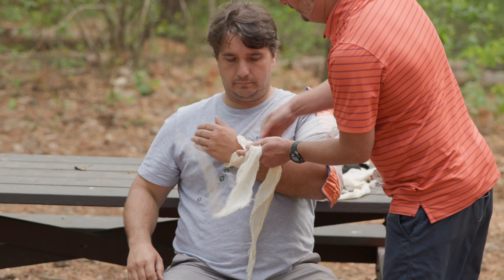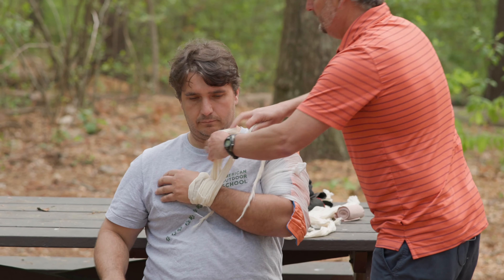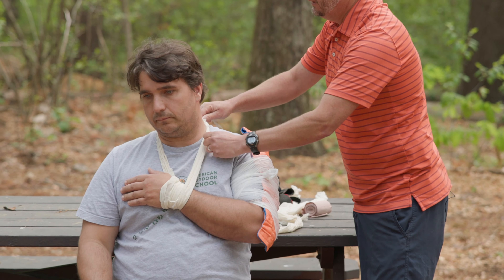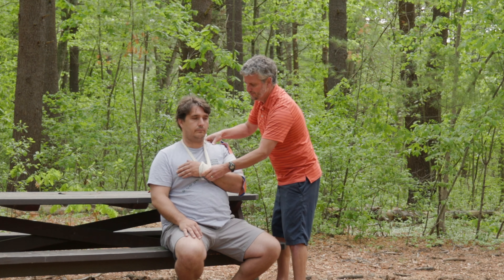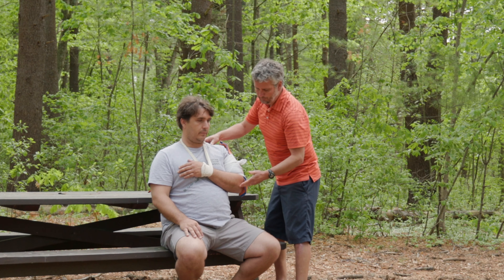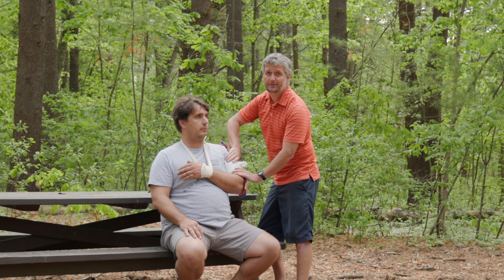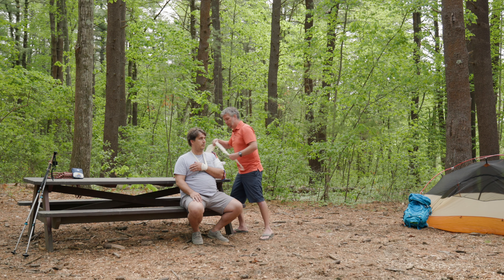I'm going to take my cravat, my triangular bandage, and I'm actually going to wrap it around the patient's wrist — just like that, a simple wrap. Now I'm going to come up and around their neck, with padding in behind, and tie the knot off to the side. What this does is it allows me to support the patient's arm from the wrist, which allows the elbow to pull down, letting gravity put some tension on this, which is going to cause a lot of pain relief.